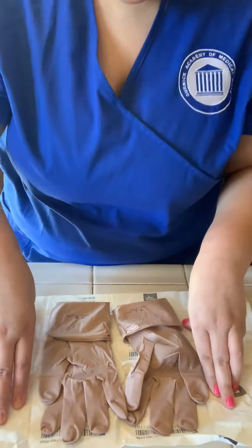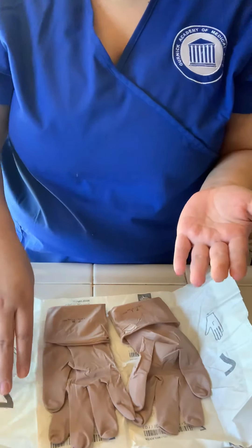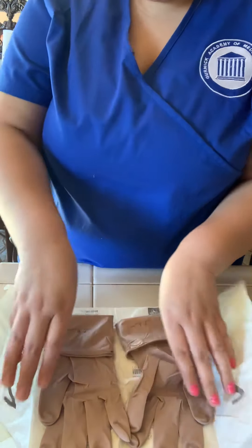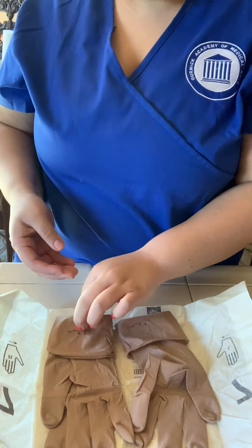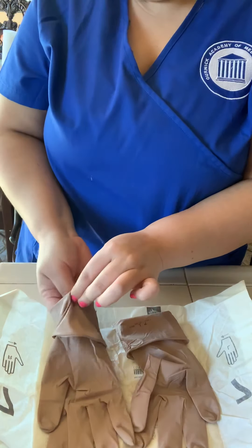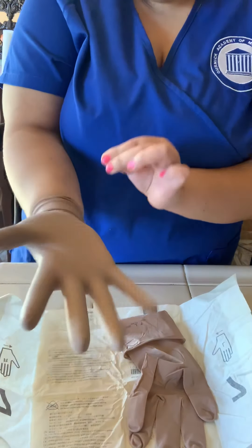Once we have it open like this, we're going to go ahead and with the non-dominant hand, you're going to help your dominant hand by touching the inside of the glove, just like this. With your thumb and your finger, help the dominant hand get pulled in just like that.